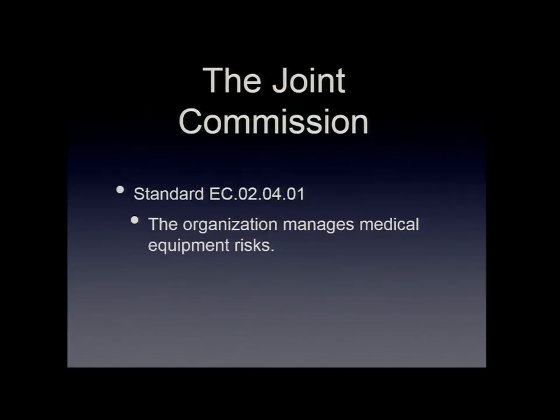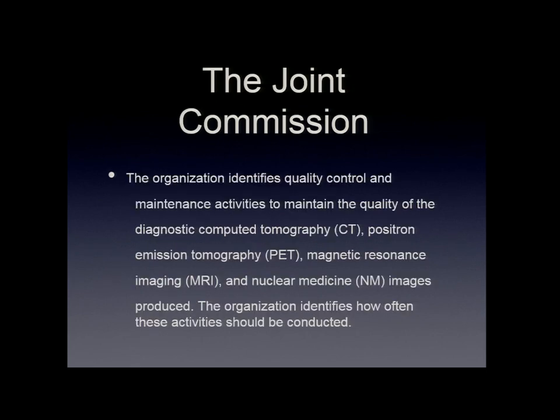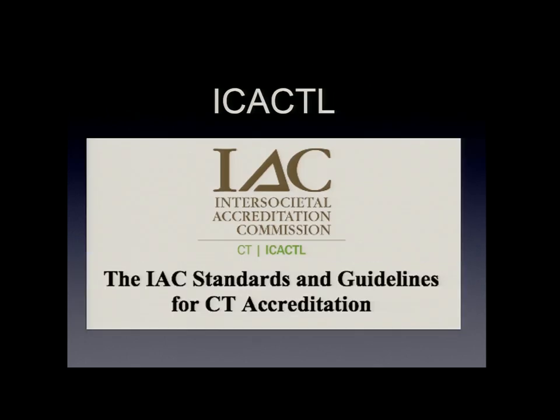The Joint Commission, actually, in their recently published standards, actually it's almost a year now, hard to believe, says that the organization just needs to identify what our quality control program is and what our maintenance activities are to maintain quality in our CT imaging facility, as well as the other advanced modalities, but we're just talking about CT. And then the organization also is required to document how often these activities need to be conducted.